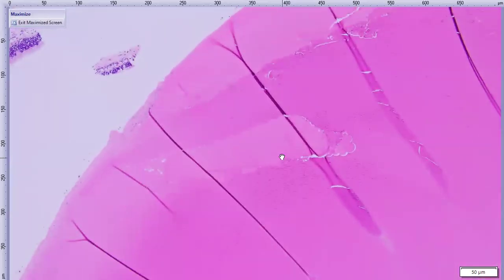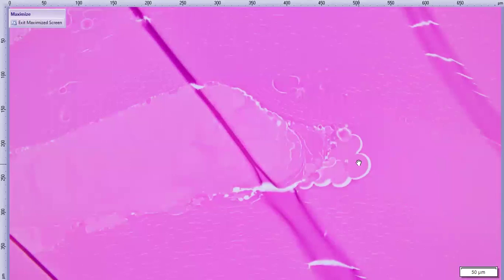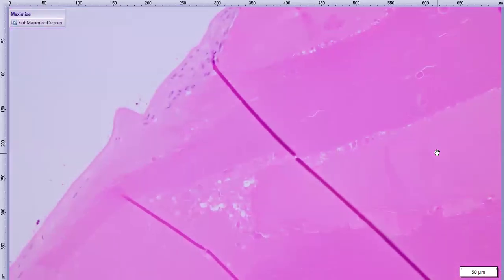There is some degree of cataract going on here. We'll just briefly take a look at that. So these lovely globules here are Morgagnian globules, and they're essentially just swollen lens fibers. And then you can still make out the lens fiber structure here and here, but then there's this big gap in the middle where it's just this homogeneous pink. That's liquefaction of those lens fibers. Essentially, it's just all liquid lens protein at that site, also part of cataract.